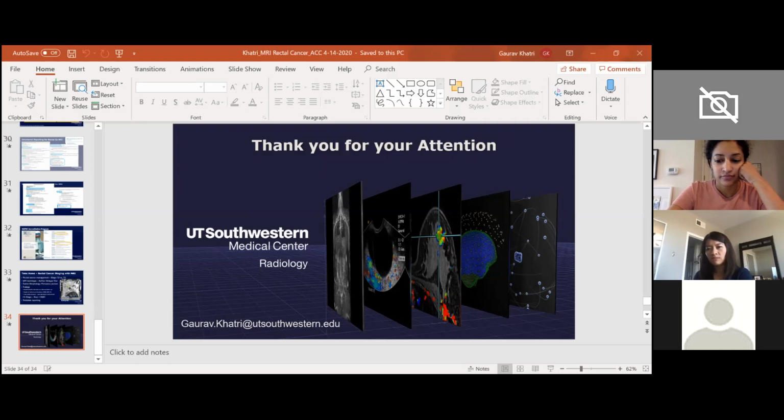I've talked to other people from the rectal cancer DFP about this, and some have similar thoughts. Some tend to say, the second you can't tell T3A from T2 apart, you call it T3A. And depending on your relationship with your surgeon, that's something you probably want to talk about. But that is a known limitation. It's hard to tell the 1 to 5 millimeter extension sometimes past the muscularis propria. Awesome. Any other questions?